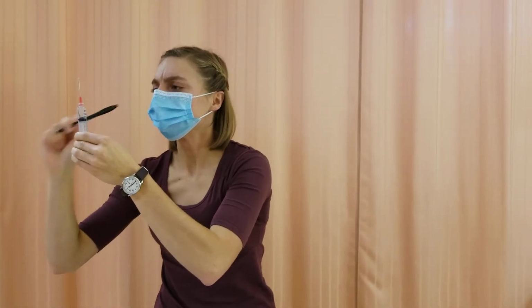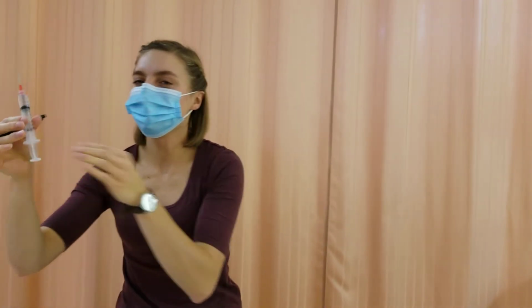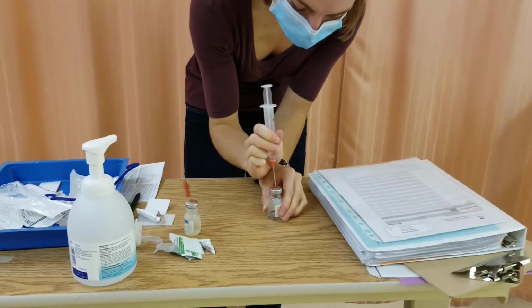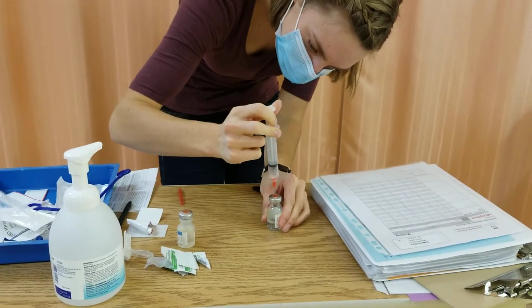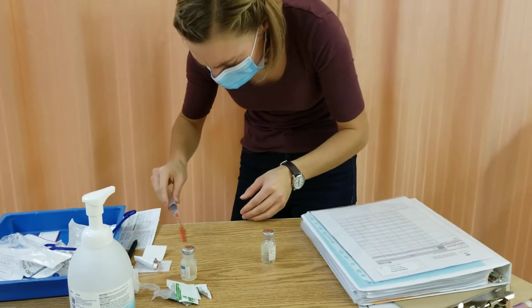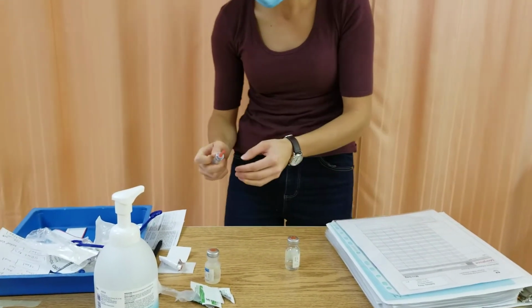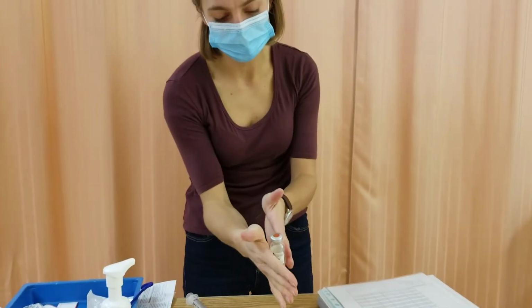So I verified I have the right patient, so I'm going to go ahead and just look at my primary line. I have 3.4 mils of sterile water. And then I'm injecting into my medication vial. So that's all good. I'm now just going to do my 30 second scrub at the bedside and put sterile on the syringe. I verified this on the wristband. And I'm just going to reconstitute this by gently rolling it around.